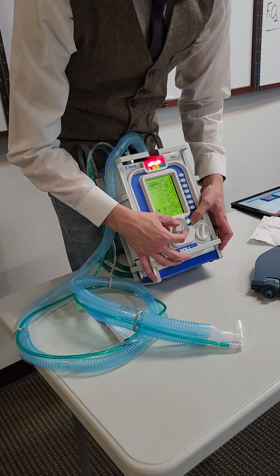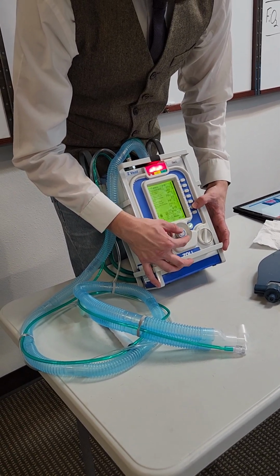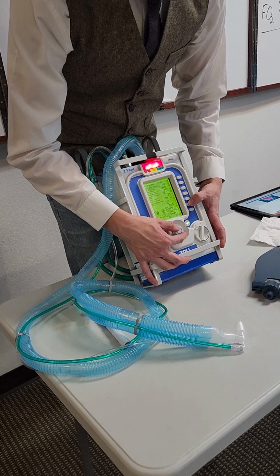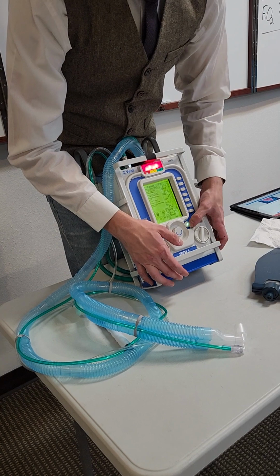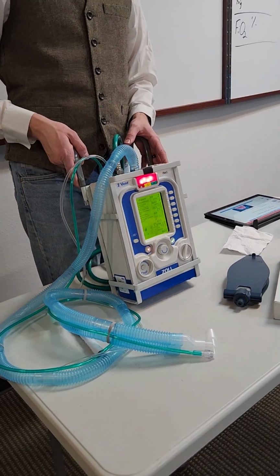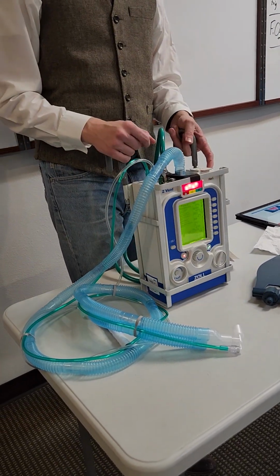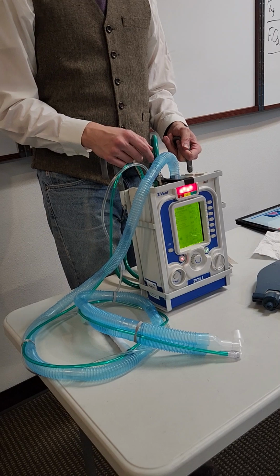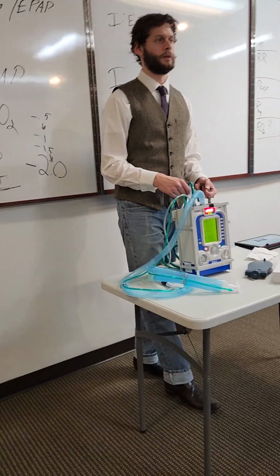And change it to IE to I time. Change to I time. We're going to turn it to 1. There we go. So you can keep going. It's just going to say patient's disconnected. It's not screaming at you, but the red alarm's there.